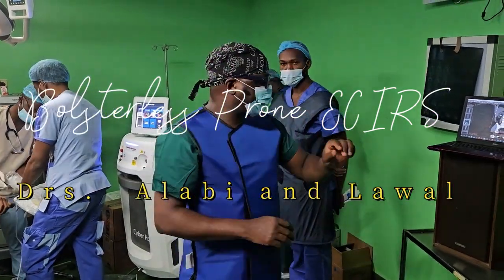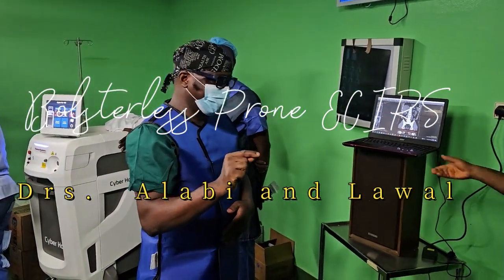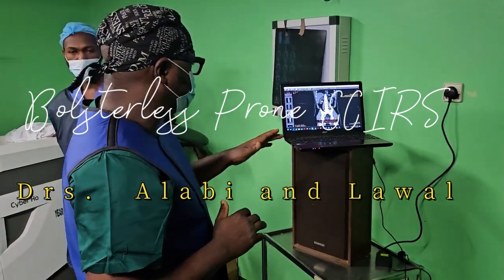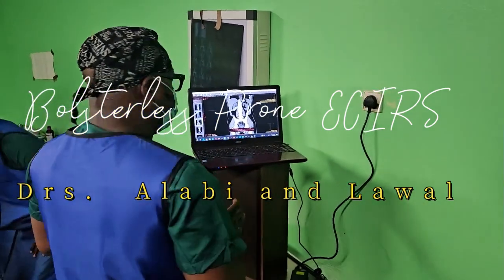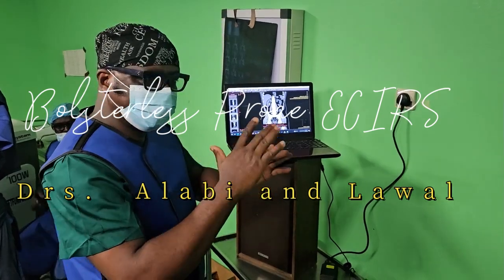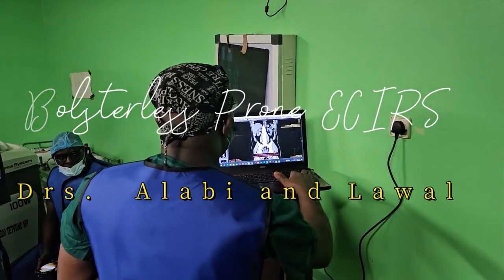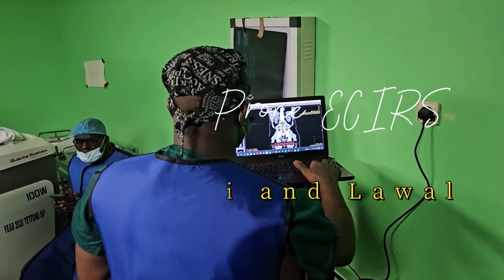Let me first say that the first step in doing an effective PCNL starts from studying the image. You have to thoroughly evaluate the image. So they are going to focus on the screen now, on the laptop. You must be able to view the image in multiple views. If you look at the screen, we have the coronal view that shows you the stone relative to the pelvicalyceal system and the kidney.